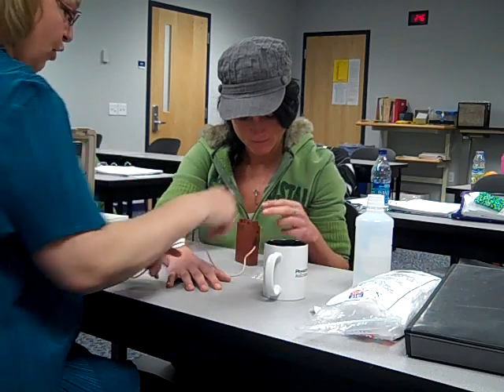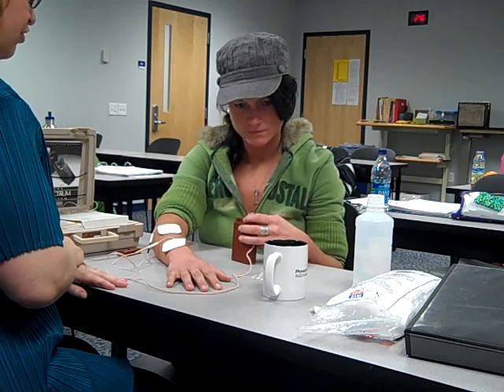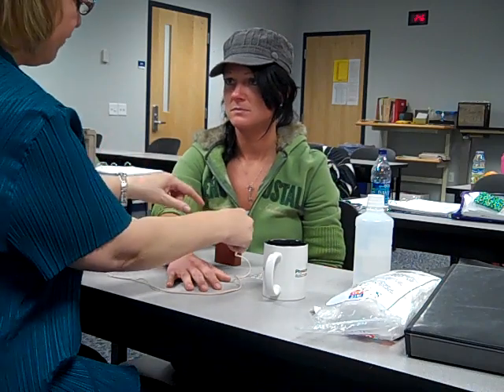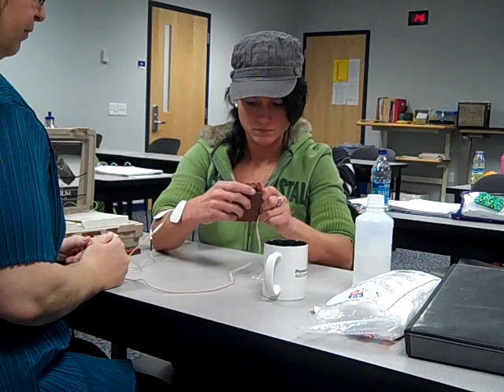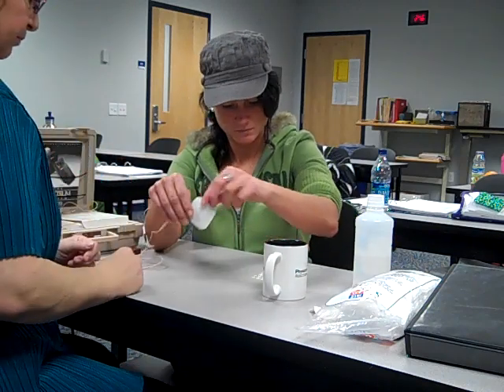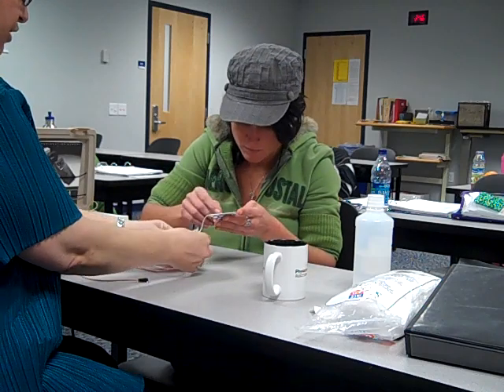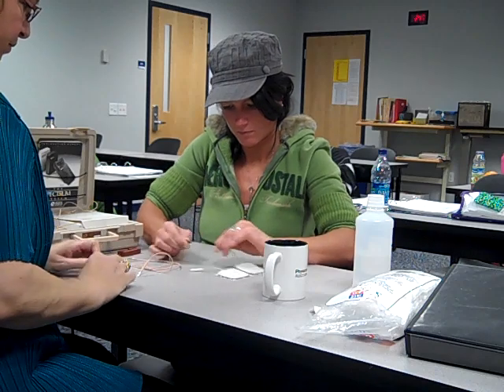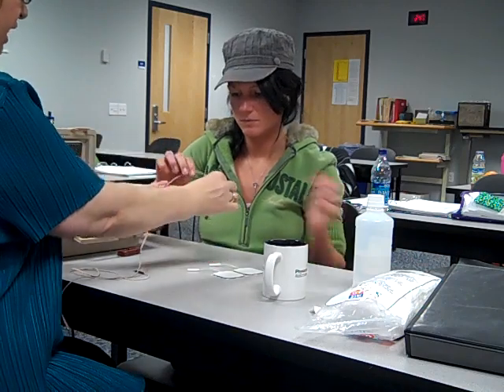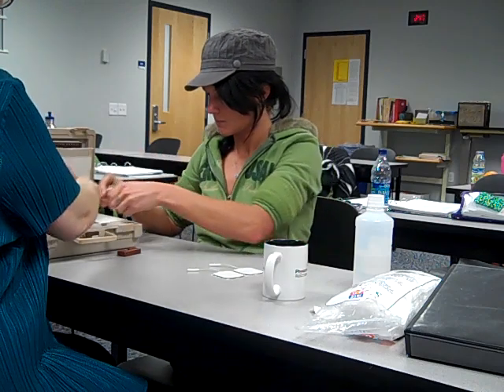I'm going to have you turn it off. Remember to go nice and slow until you make sure you're going the right direction. Once you know you're going the right direction, you can continue to just turn it right off. Now if you were taking a shower at home and needed to take these off, you can just unplug the lead wires. Then you can take these right off and put them back onto the plastic. Take the lead wire right off the electrode. Make sure that when you put it into the box, you kind of wind it around your fingers like that — never crease these.